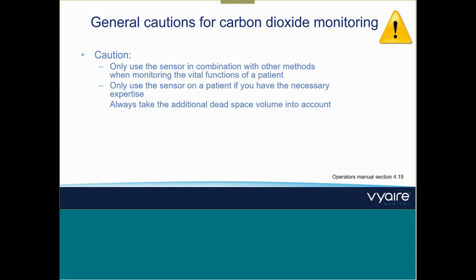Think about the dead space on the Bellavista in pediatric and also in neonatal. When you start CO2 measurement or monitoring, you always get an info message to think about the dead space. So this is just a reminder that you should take this into account, whatever configuration you have chosen. This adds dead space, and premature neonates can sometimes already suffer from 2 or 3 milliliters of dead space.